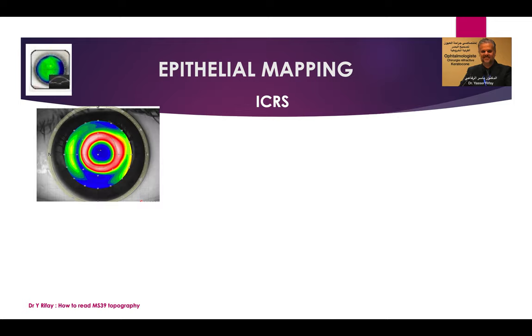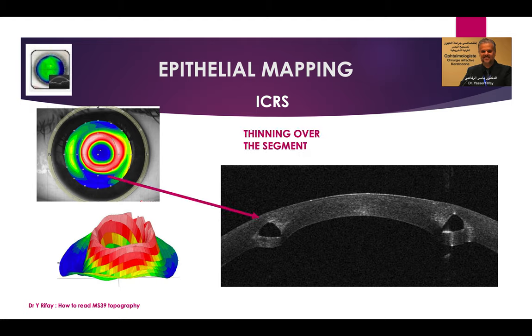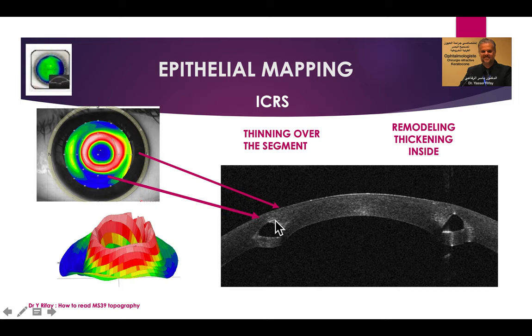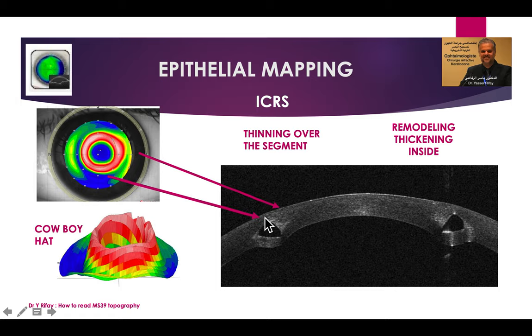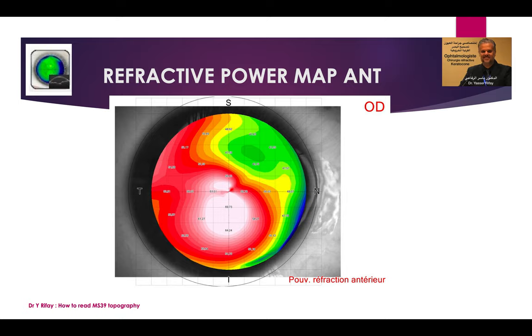This is the behavior of epithelial mapping after intracorneal ring segment implantation. We see epithelial thinning over the segment and a remodeling effect inside — the epithelium fills the gap created by the ring, producing a red area of thickening just inside the ring. You also have the normal thinning at the apex of the keratoconus. This creates a characteristic cowboy hat pattern.